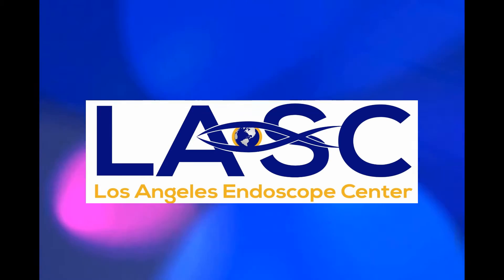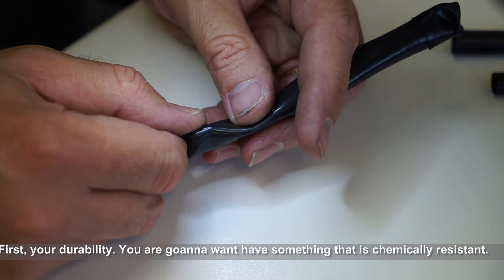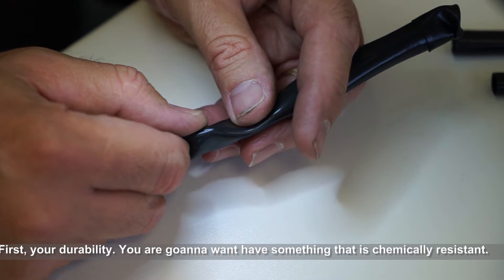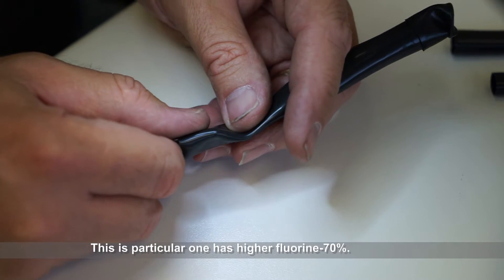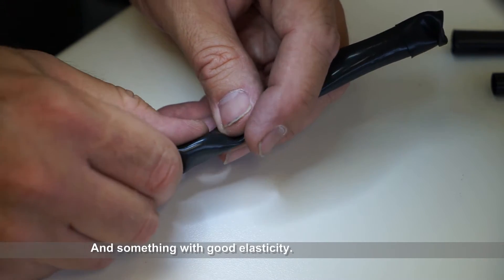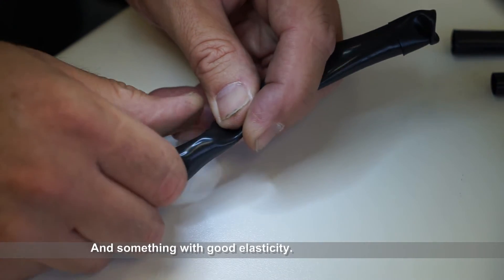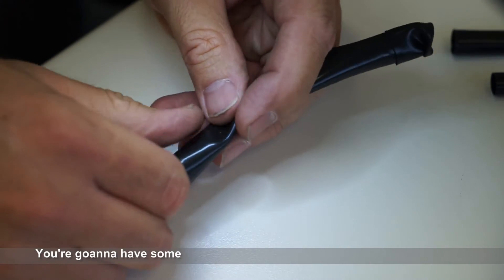Proper selection of a bending rubber. First, your durability. You're going to want to have something that's chemically resistant. This particular one is higher in fluorine, 70%, and something with good elasticity because the doctors aren't going to be good to it.